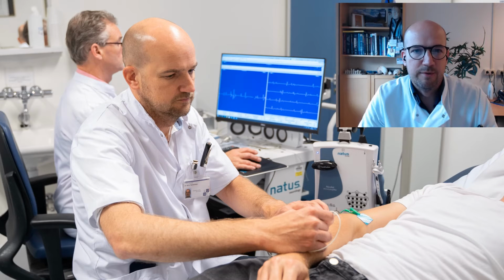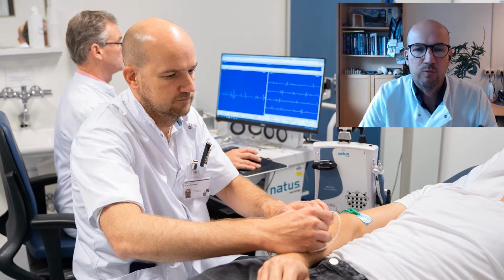This is what it looks like when we perform a needle EMG. We stick a needle in a muscle and record these strange looking squiggly lines on the screen while mumbling inexplicable phrases like polyphasia and long duration motor unit potentials or a reduced interference pattern. In this video, I'll try to explain the underlying processes going on in the muscle that result in the signal as we see it on the screen in healthy subjects, in patients with nerve lesions, and in patients with myopathy.